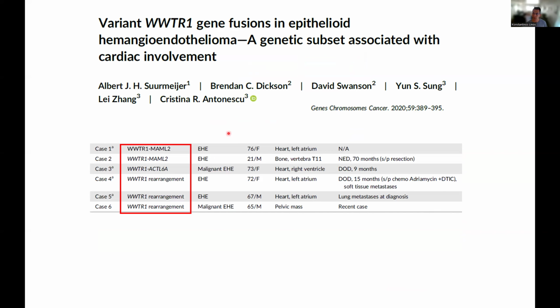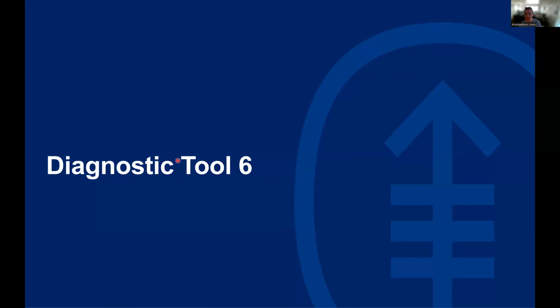You have to be aware, although this has not been seen in the dermatopathology world, that some WWTR1-fused hemangioendotheliomas don't have CAMTA1 as a partner. So expectedly, this immunohistochemistry will not pick those up, but it has never been reported in the skin so far.